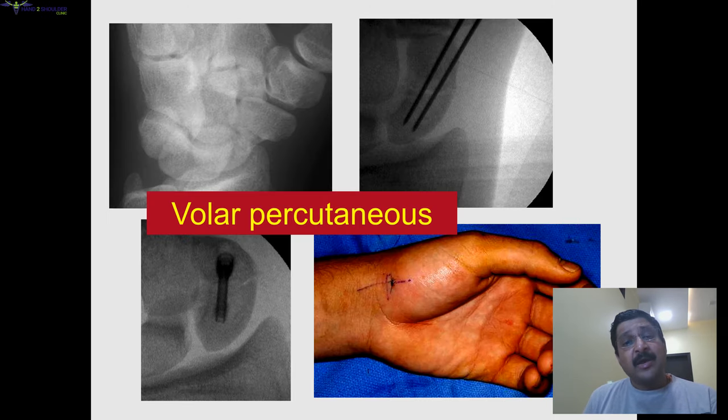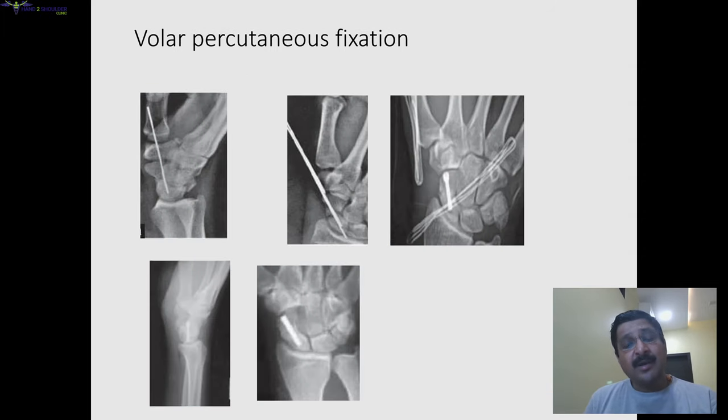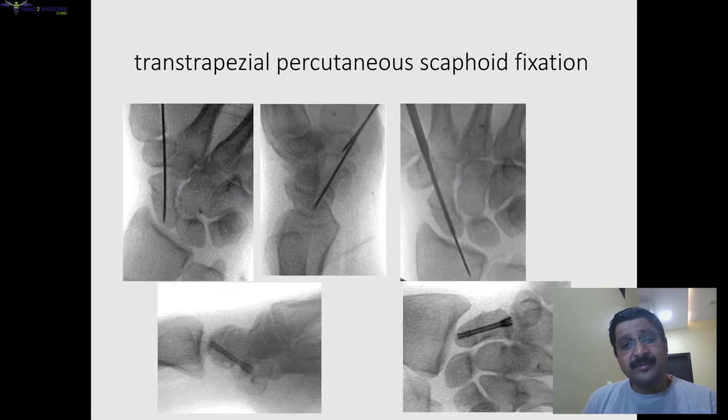The same technique can be done percutaneously using a volar approach. In the volar approach, we pass a screw from the scaphoid tubercle in a retrograde method as shown in these pictures. We have to dorsiflex the wrist so that the distal scaphoid and scaphoid tubercle become prominent, making it easy to insert the wire. A simple hypodermic needle can be used as a sleeve and also helps in directing the guide wire.